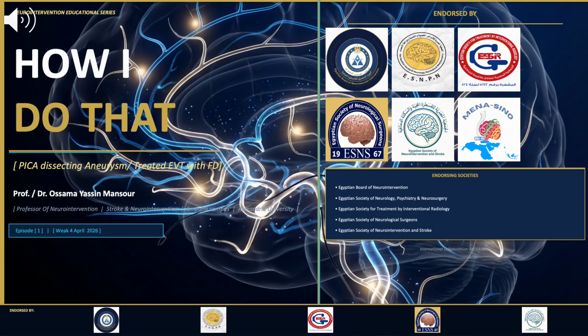Case Overview. This episode focuses on a PICA dissecting aneurysm treated with endovascular therapy using a flow diverter. We will walk through the clinical reasoning, procedural strategy, and technical execution step by step.